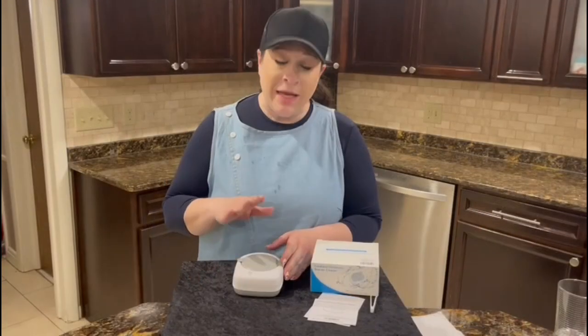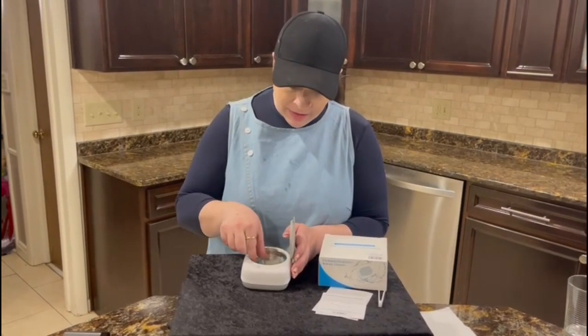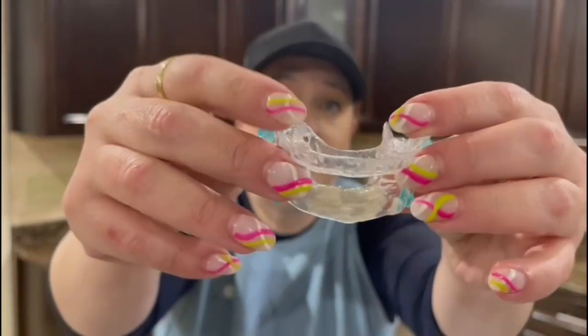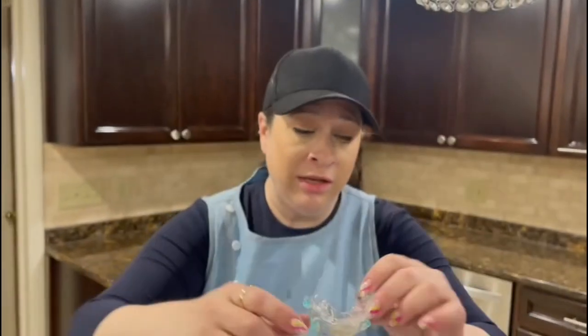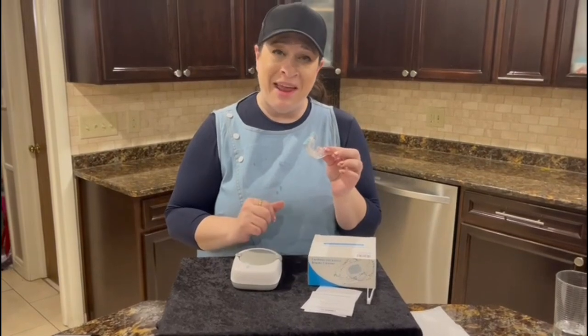It has run for five minutes and it automatically turned off. So let's open it up and see how we did. Oh wow — it is much, much cleaner now. It really did a fantastic job of 360 cleaning, and I highly recommend it. I hope you enjoy.